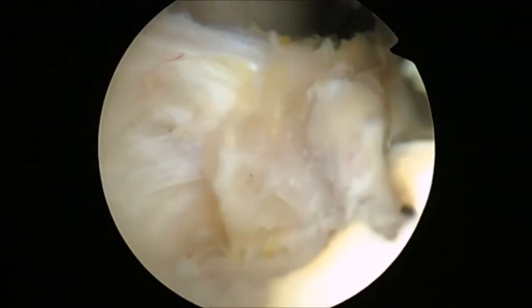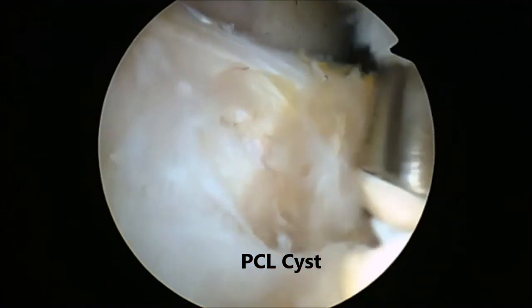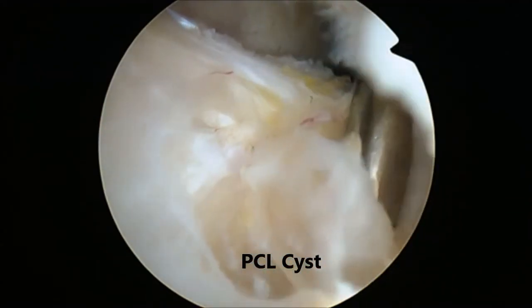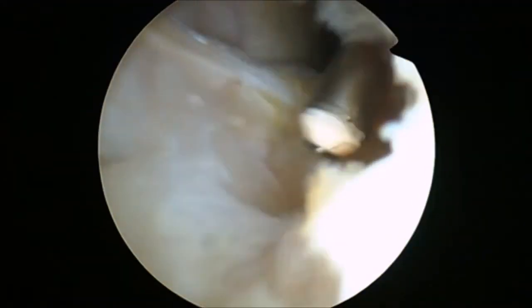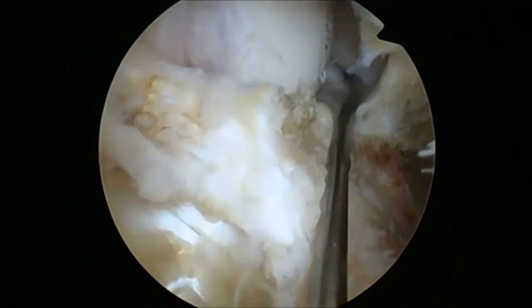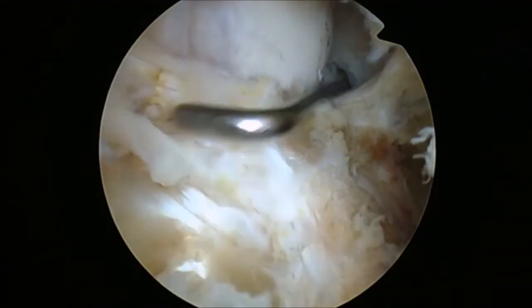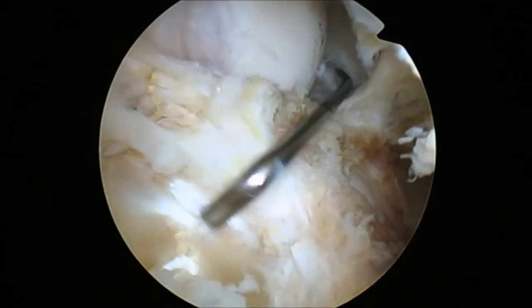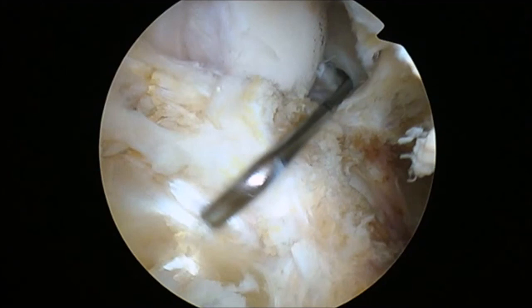The PCL cyst is now identified, dissected, and completely excised. After the complete removal of the cyst, structures that were underneath it are now visualized and we can see a clean and intact ligament.